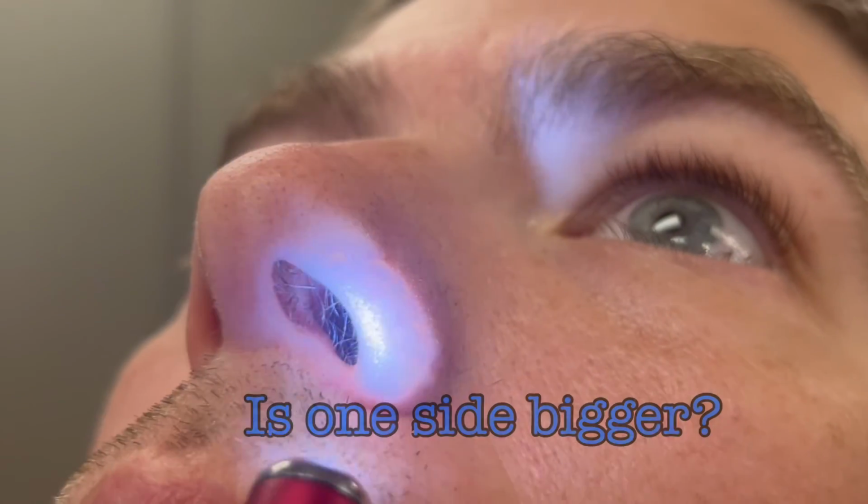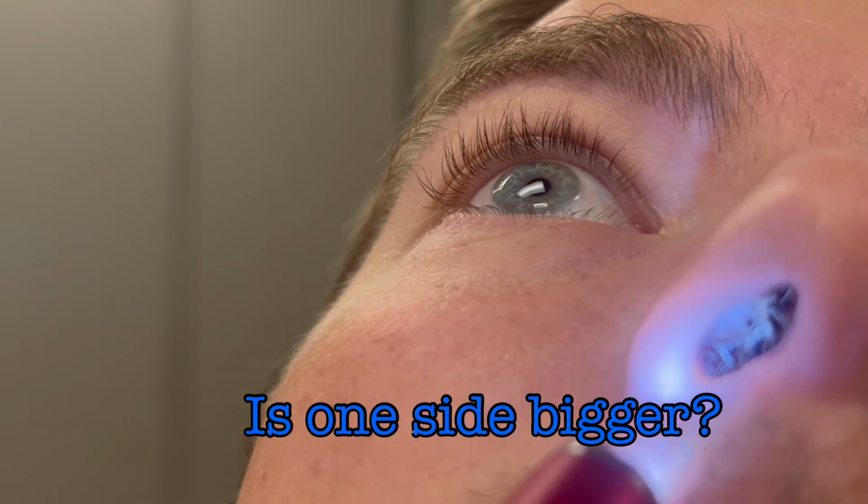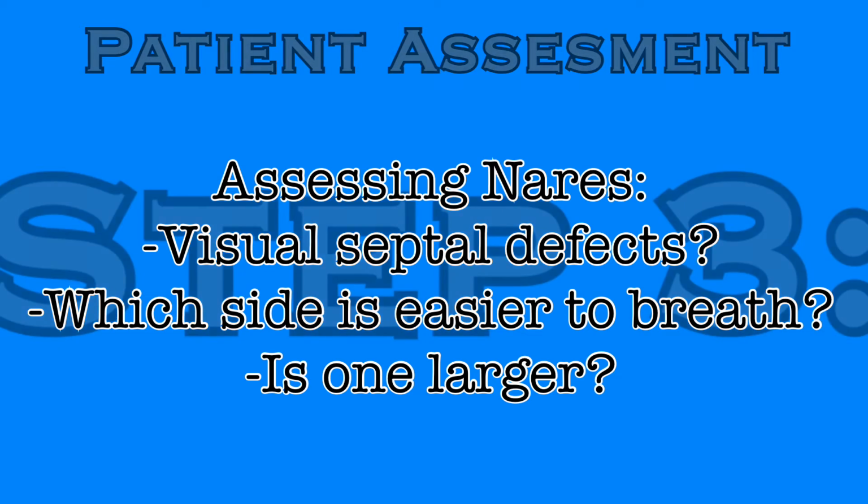Then look into their nares for general size. Nares aren't actually identical. Inserting into the larger nare will be easier. Clearer breathing implies a clearer nasal canal, which means less resistance. Choose the nare that gives you the easiest insertion. For me, I was breathing well through each side, but my left nare is larger than my right, so I would choose to insert into the left side.